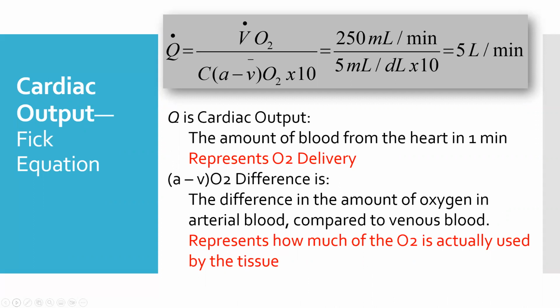The basic premise under which it operates is this: if all else is constant, as cardiac output drops, the difference between SaO2 and SvO2 will widen. It will become greater, in a fairly predictable manner.